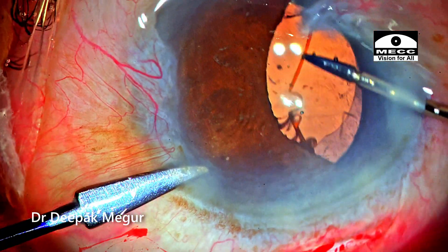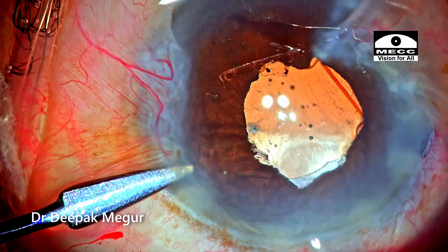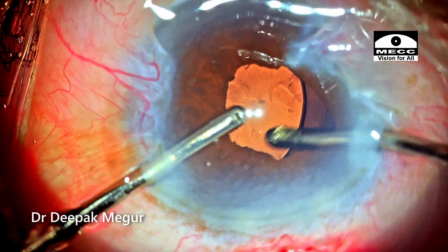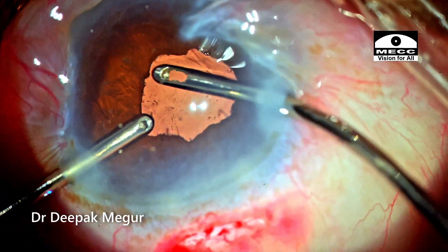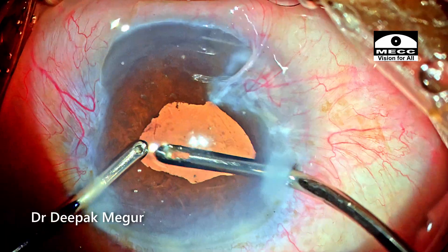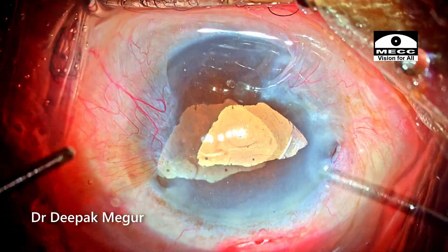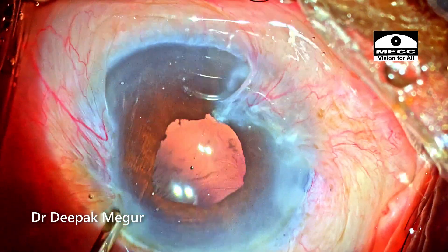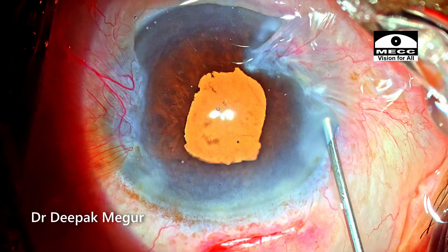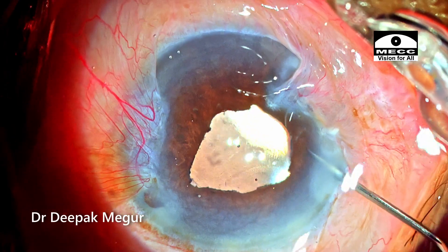Using micro forceps to remove the B-hex ring, it is disengaged through the side port and, once all the notches are disengaged, easily explanted out of the eye. Time to remove the OVD from in front and behind the lens. As I'm doing that, the iris has now become really floppy and is trying to come out through the side port, also hinting at coming to the main port. At this stage it's really not of much significance because the surgery is almost complete — it was good that the iris held off well until now. During stromal hydration, the iris tries to peep out and care is taken that the iris is not sticking at the side port before closing.